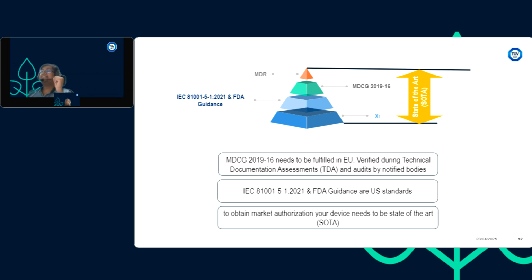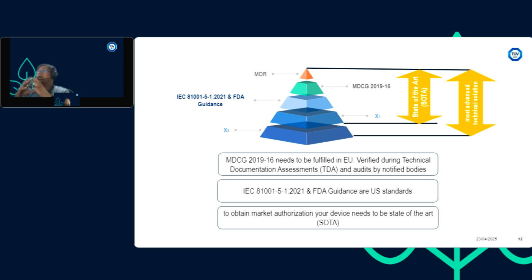Now, does that guarantee a 100% safe device? A cyber safe device? Unfortunately, no. Okay. Now here we need to understand in a very pragmatic way. We have on one hand safety and on the other hand security. Now, in case of safety, up to certain degrees, you can pretty much define what exactly can go wrong with my device. Okay, you can know after running this many times this device fails, or if I use this particular set of angles or this particular set of inputs, my device fails and the patient can get hurt.